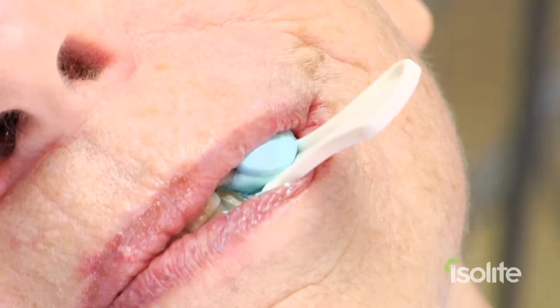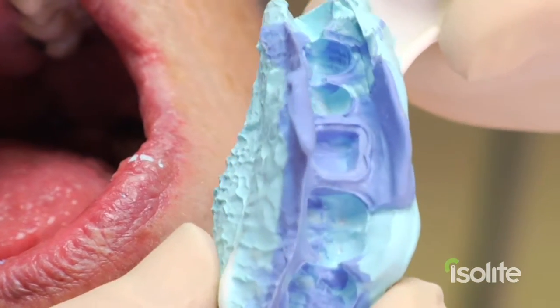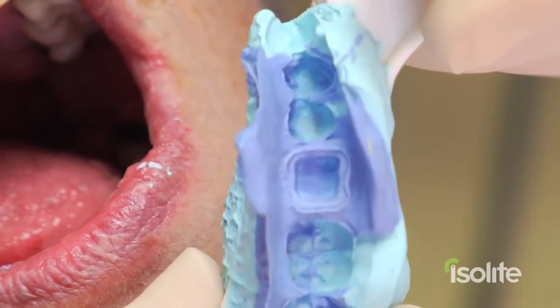It's great not fighting the monster tongue or battling saliva. We're now removing the triple tray and evaluating all of our margins. You can see they're very nice, clean, clear, and concise — no blood, no saliva. Perfect impression.